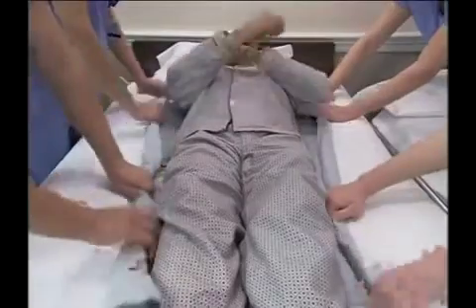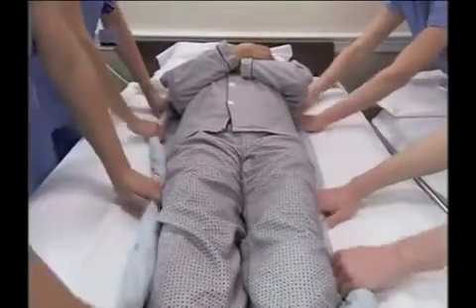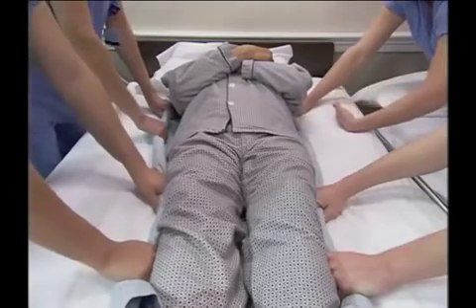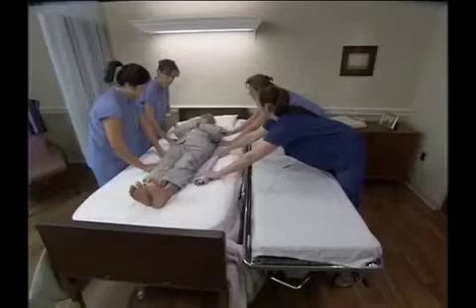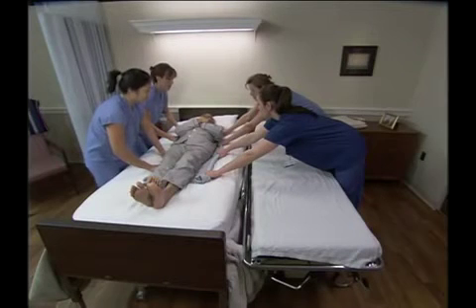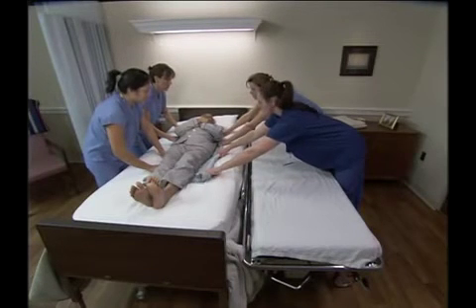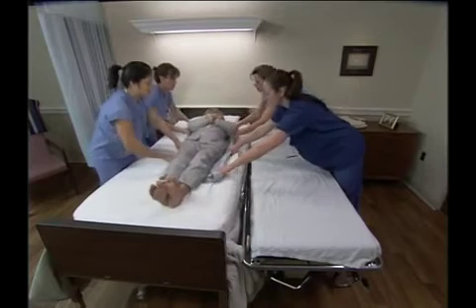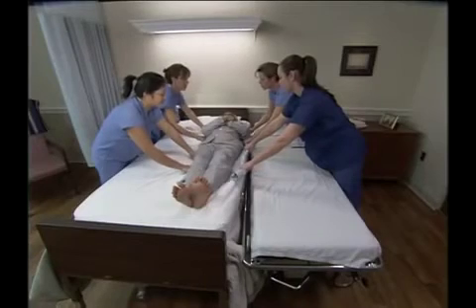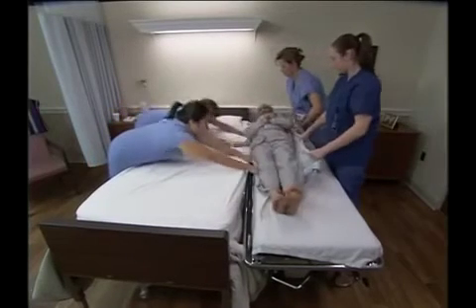All 4 assistants should grasp the edge of the lift sheet and roll it over as close to the person's body as possible. This will provide for a better grip. On the count of 3, all 4 assistants slowly, carefully, and in unison lift up on the lift sheet and move the person to the side of the bed. Then, again on the count of 3, all 4 assistants lift up on the lift sheet and move the person to the side of the stretcher.